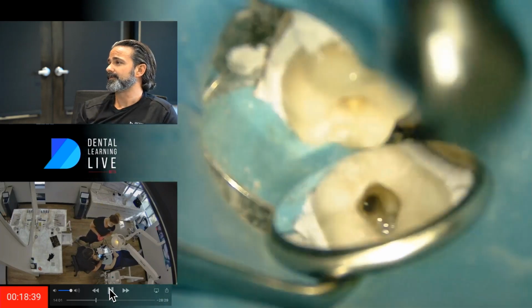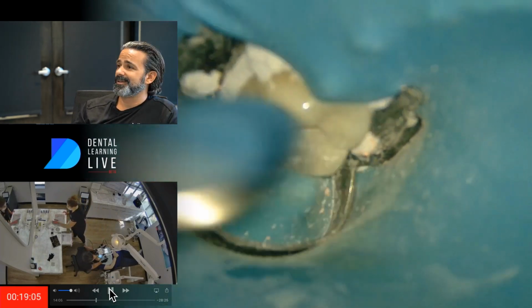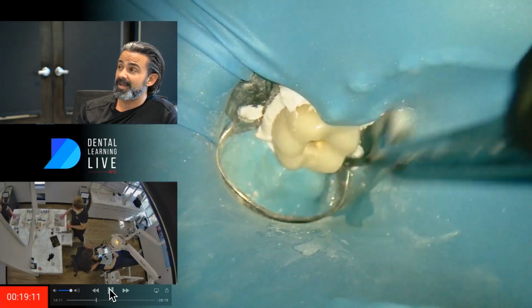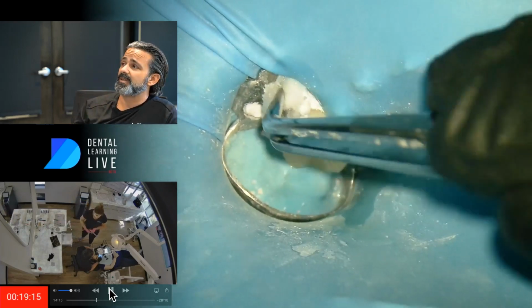Okay, well, it looks like we're gonna get ready to go here. So the next step for me, once I feel like I've done my job and removed and debrided everything inside there to the best of my ability, now I'm thinking commit to the GentleWave.